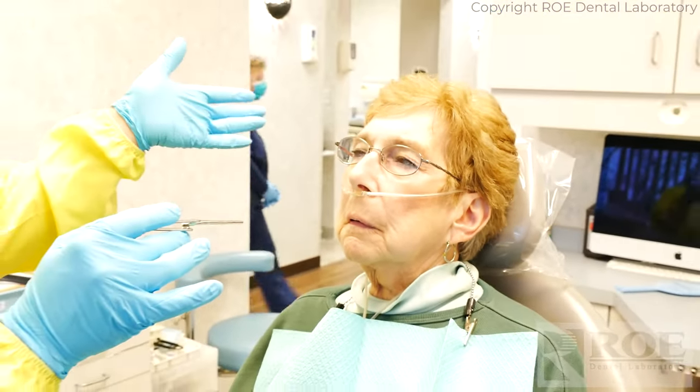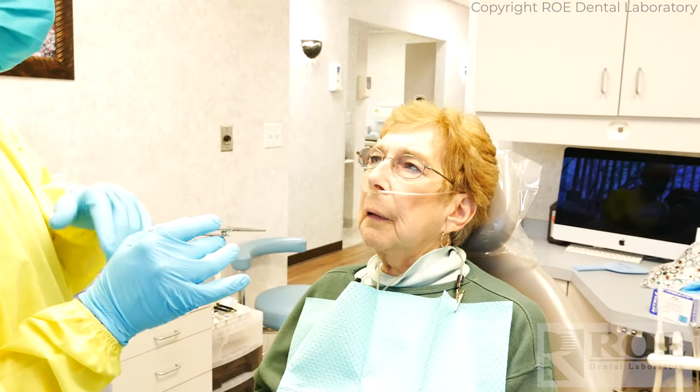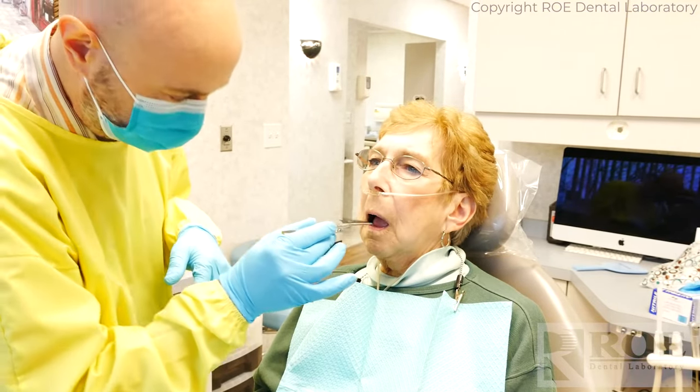Nice class two. Now, which bite am I going to look for? Don't worry about which one. I'm going to put some tape between. You're going to bite down — even if you bite in the back, I'll ask you to slide forward. Then I'll say grind your teeth for me and you go back sideways. No worries, don't overthink it.